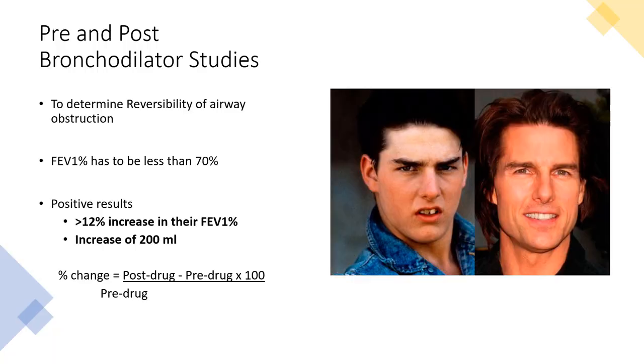All right, so that was peak flow. There's other kinds of studies called the pre and post bronchodilator studies. They show how reactive your airways are. And so this is to determine the reversibility of airway obstructions, the reversibility.